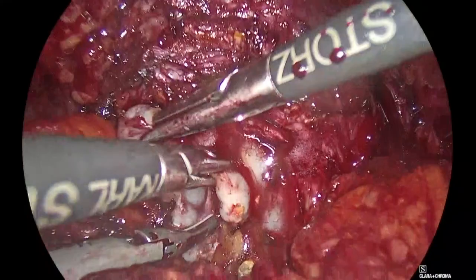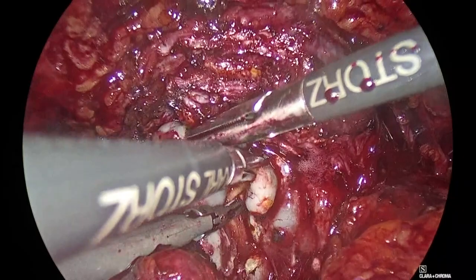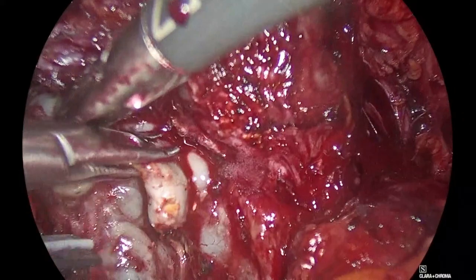Now, centrally, you don't cut. You normally dissect like this. So the tissue, come closer, Padeli, comes down. You don't need to cut between the vas. Good. I'll go on the right side here.